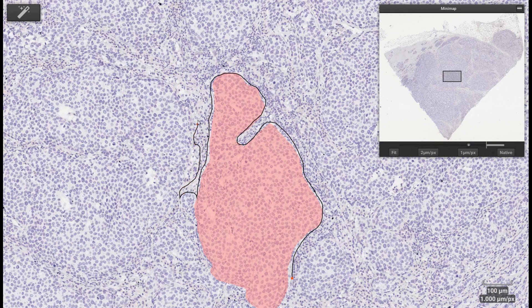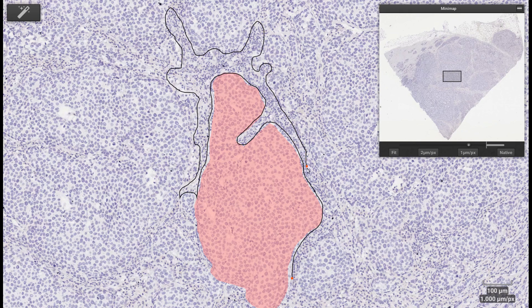The pathologists provide their unique expertise in a convenient way by providing example regions for the different tissue types to then train the system on the fly. Here we outline one region for tumor cells and one region for stroma cells.